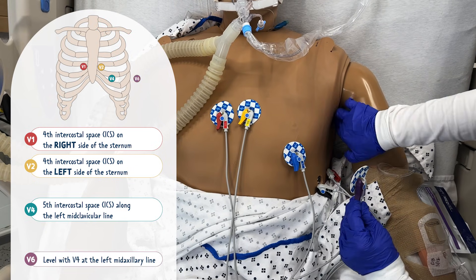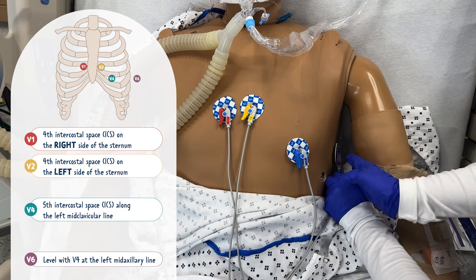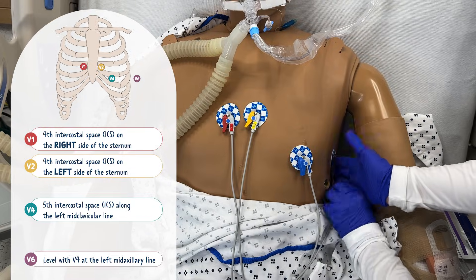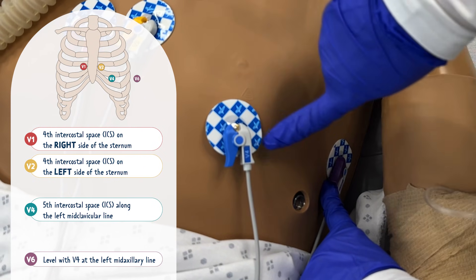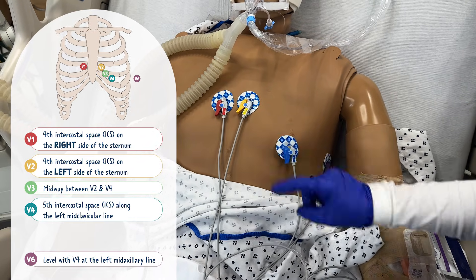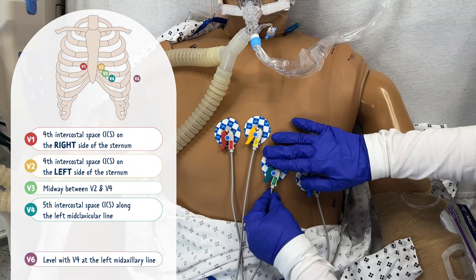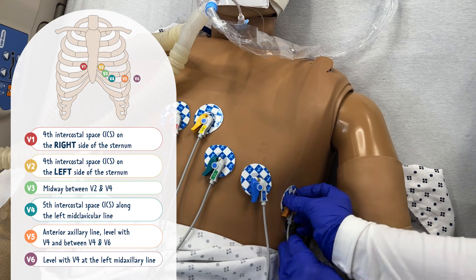Now for V6 — it's placed level with V4 along the left mid-axillary line, which is straight down from the patient's axilla. For the leads we skipped: V3 is placed midway between V2 and V4, and V5 is placed in line between V4 and V6.